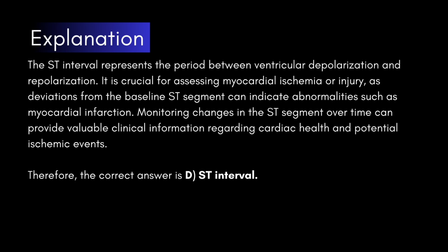It is crucial for assessing myocardial ischemia or injury, as deviations from the baseline ST segment can indicate abnormalities such as myocardial infarction. Monitoring changes in the ST segment over time can provide valuable clinical information regarding cardiac health and potential ischemic events. Therefore, the correct answer is D, ST interval.